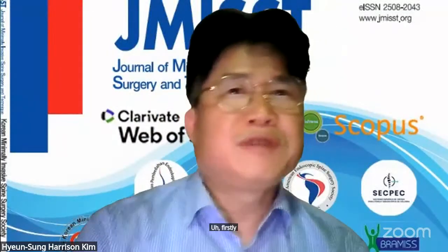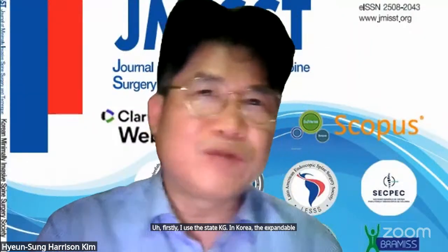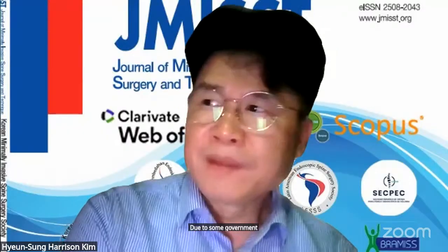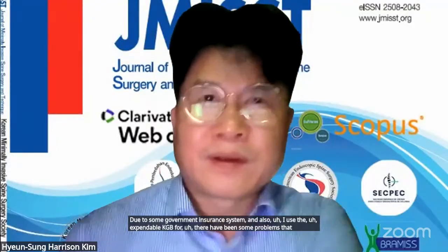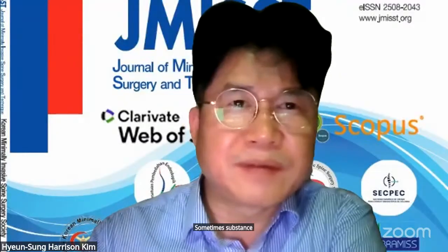Firstly, I use the static cage. In Korea, the expandable cage is not very useful due to the government insurance system, and I also used the expandable cage before. There were some problems, sometimes subsidence or sometimes fracture. Because of that, I prefer the static cage.